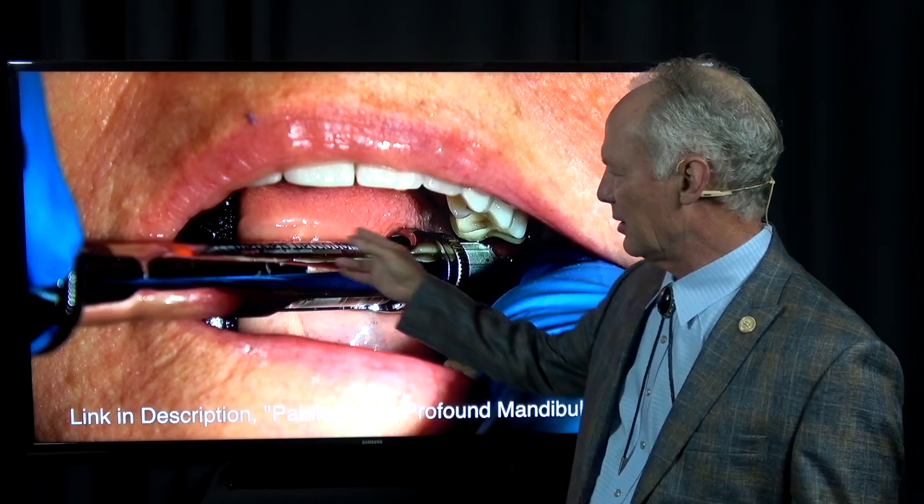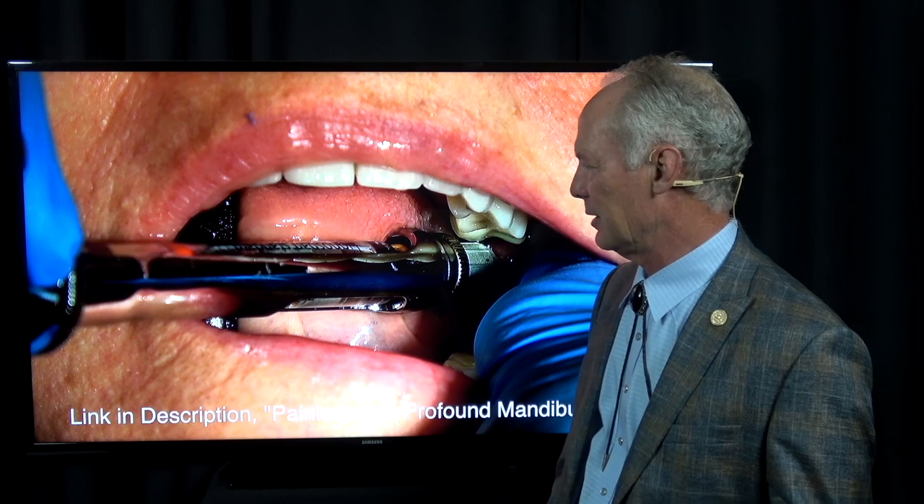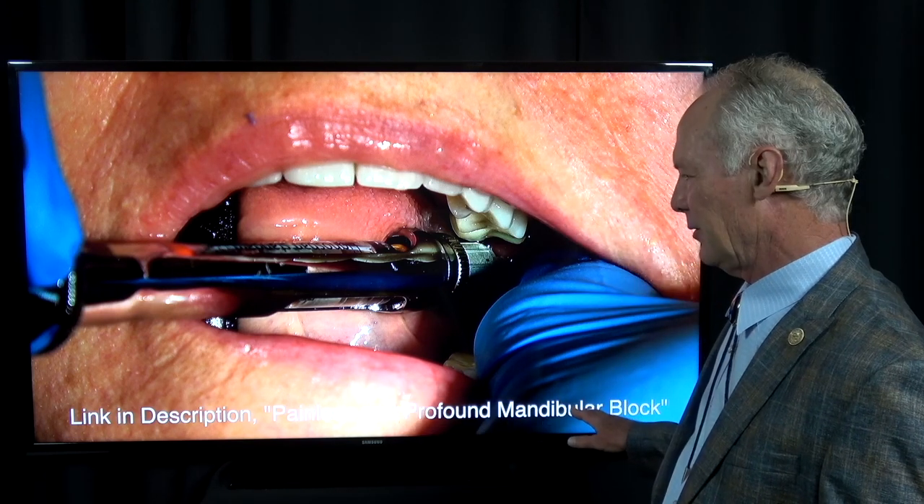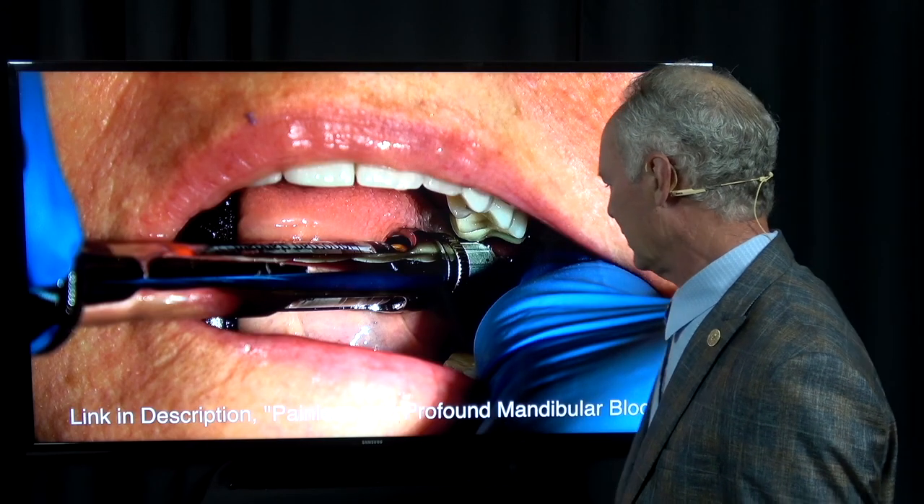Then I follow that with a 27 gauge long and lidocaine 1 to 100,000 epinephrine. You can look at the videos in the library of dentistry master classes on how to give profound and painless local anesthesia.